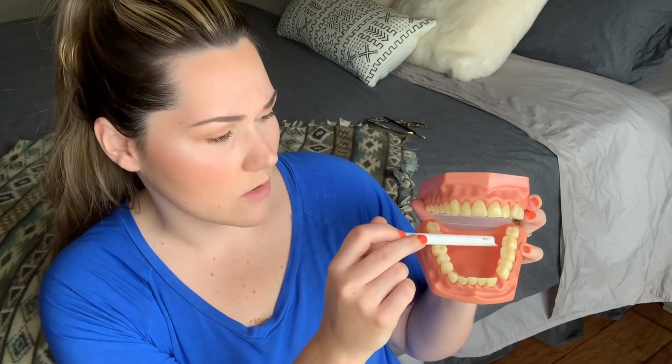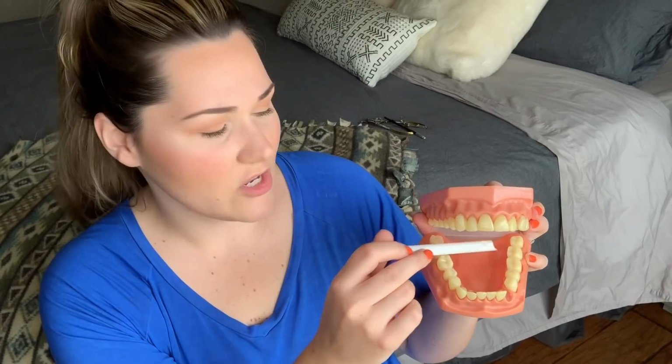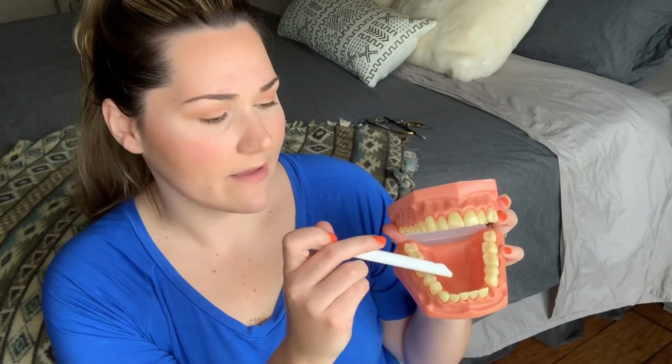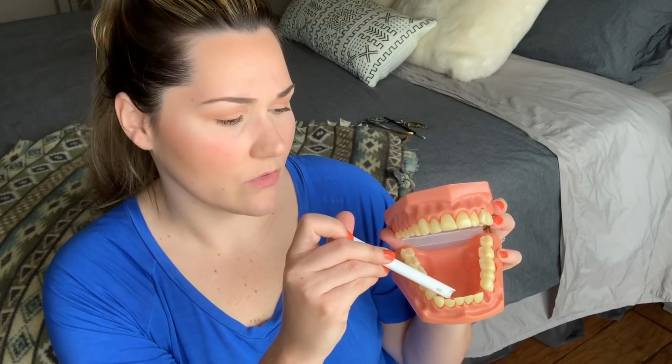I usually just put it down here like so, or back here. And you can move your suction around. If you start to see some water puddle up, you can move it over here and suck it up. And then if you're doing anterior fillings, I'll usually go like this while he's working on these, you know, 24, 25. You can curve this way. So this end is facing towards the tooth.